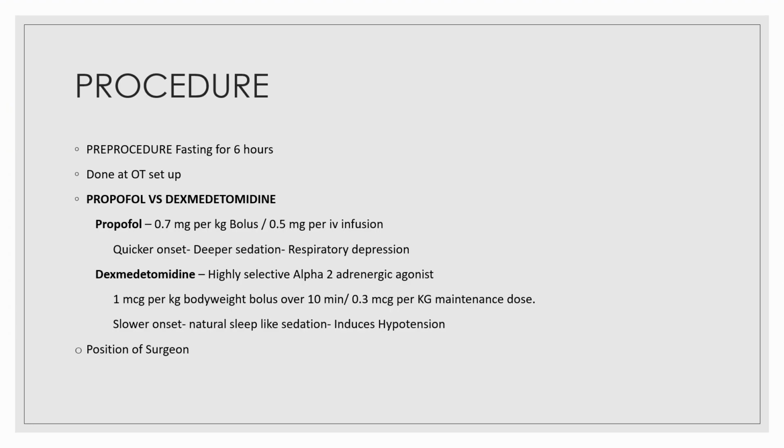of sleep is almost instantaneous with propofol, but it can sometimes take the patient too deep, and that is not ideal for evaluation of a sleep patient, because we want the patient in a natural sleep-like level. So sometimes with propofol, if you are not careful about the dose, it can lead to a deep sedation, and propofol can sometimes cause respiratory depression, which is an issue.